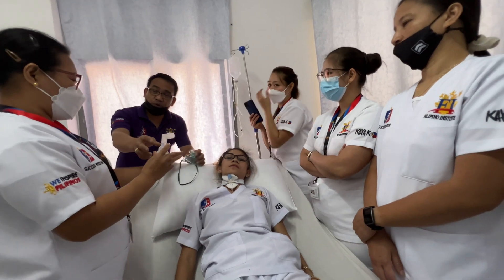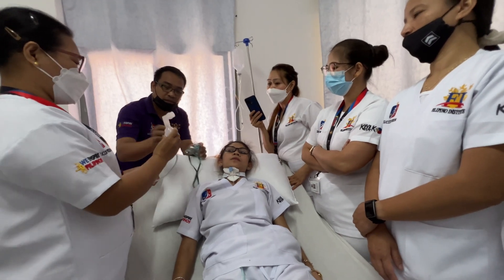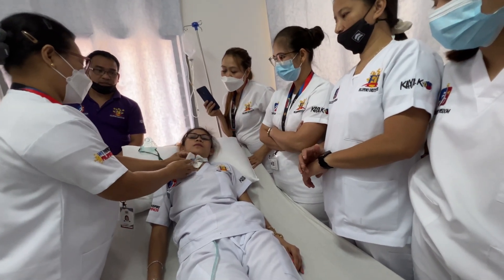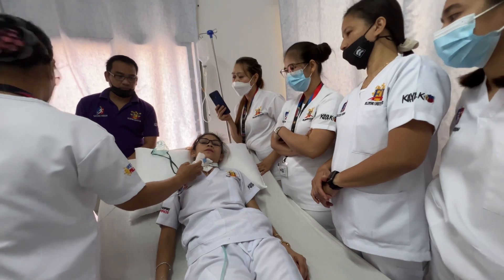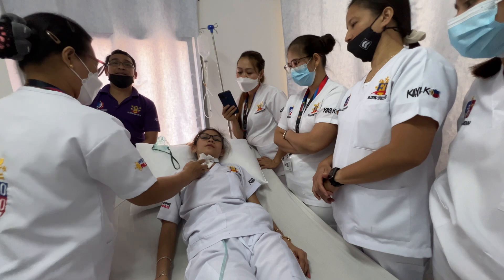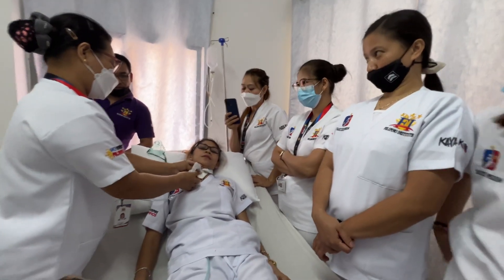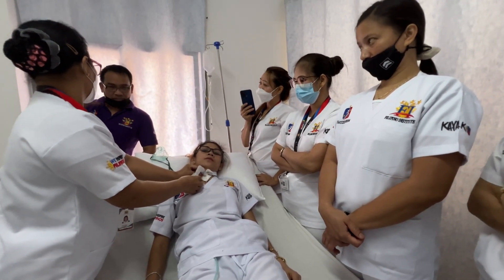If you want, you can put it here — much better. If you want to direct it, remove the oxygen mask and put the tube directly. Open it. Place it in. How many minutes? It's almost five minutes — it's done. Five minutes already done.